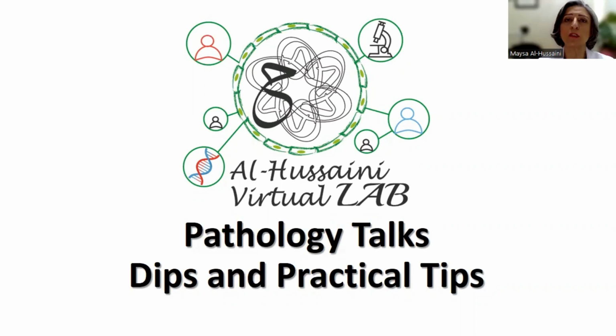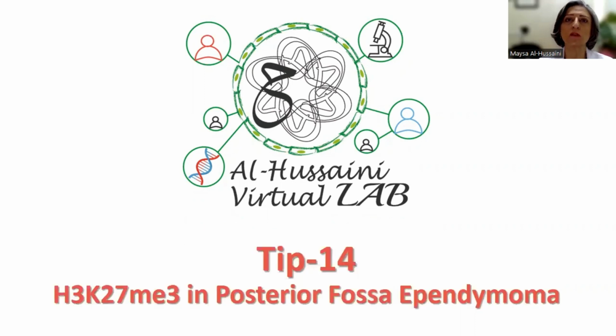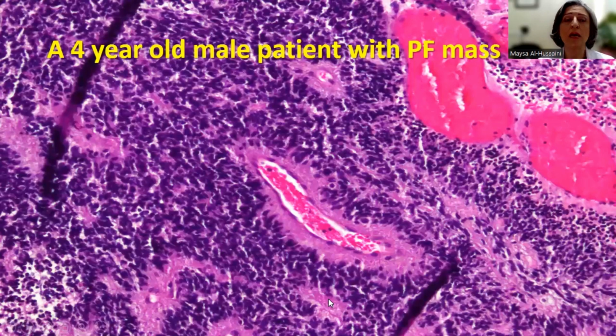Today, I'm going to continue with the other uses for the newly introduced immunohistochemical stain, the H3K27me3, and this time is in posterior fossa ependymoma. This is a case of a 4-year-old male patient with posterior fossa mass, and as you can see, it's really a highly cellular tumor with hyperchromasia, foci of necrosis, and a tendency for perivascular arrangement, or what we call the pseudorosette. So it really is reminiscent of ependymoma.